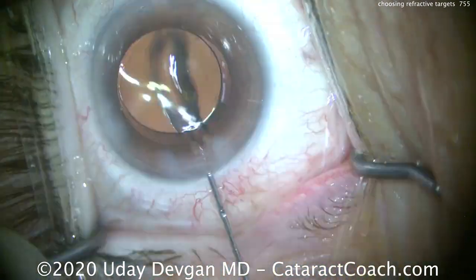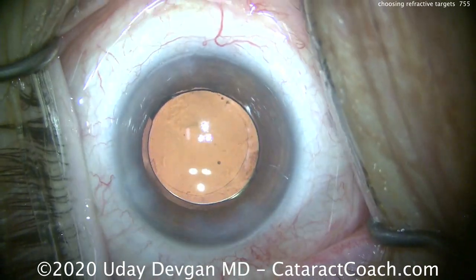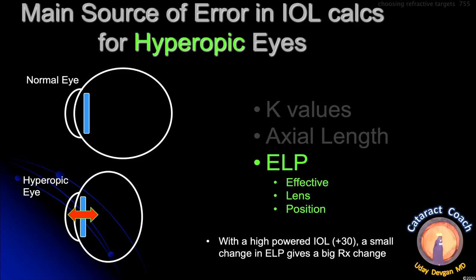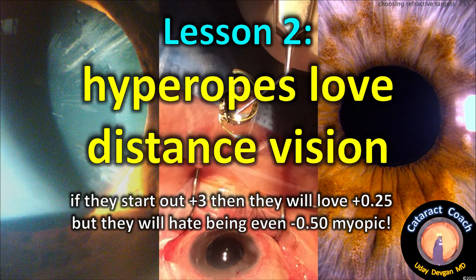Once the IOL goes in the eye, we'll dial it into position and the patient should do well. The lens calculations are tough because these small eyes make it very difficult to determine where the lens will end up — what's the ELP, the effective lens position? It's hard to determine exactly. When in doubt on these eyes, make sure we end up a little hyperopic. Lesson two: hyperopes love distance vision.